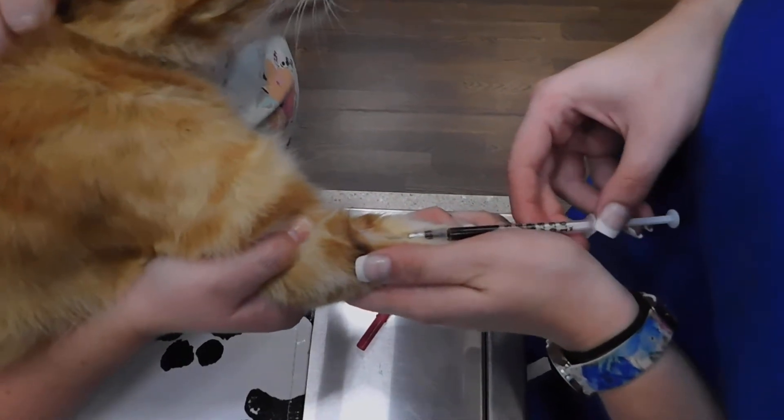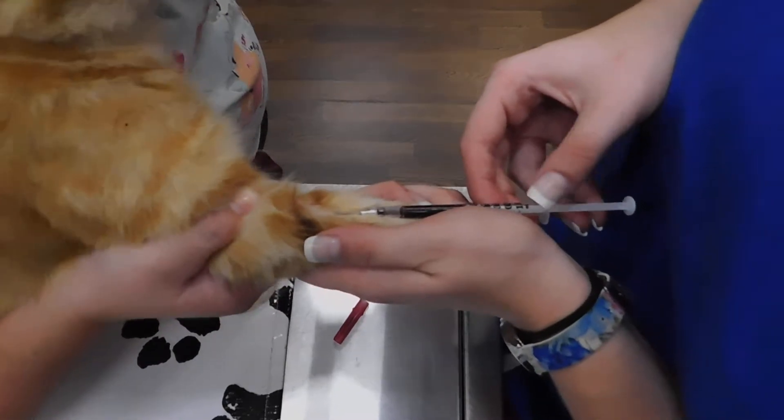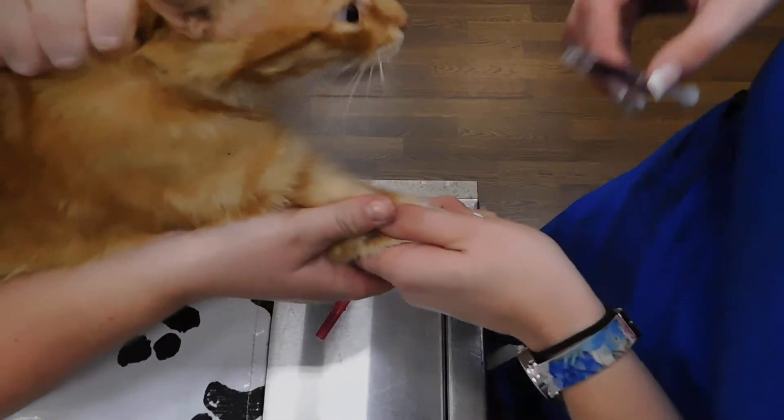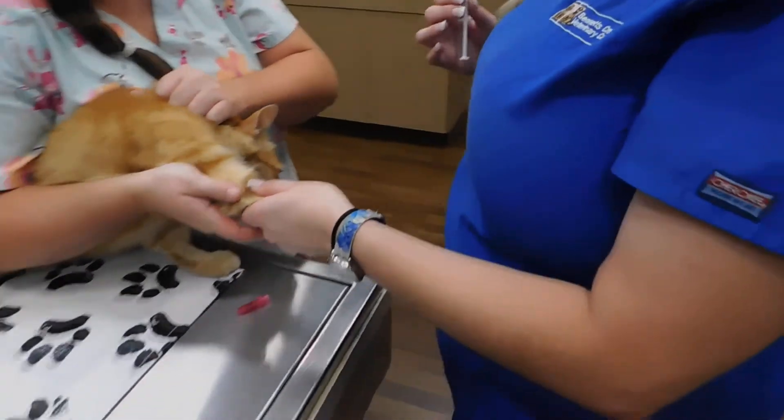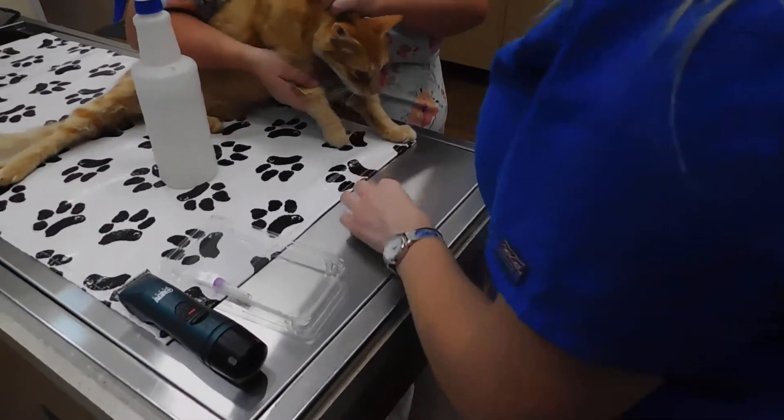We just need 0.5cc. Now that we have our 0.5, I'm going to hold off the vein, and I'll give that to the assistant to continue to hold off just to prevent any hematoma.